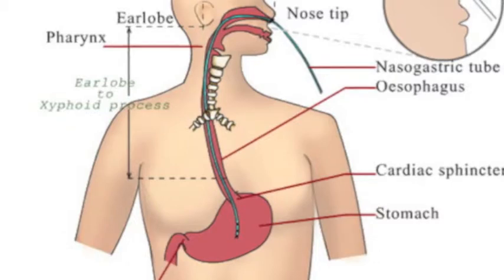Xiphoid. Anyway, xiphoid, which is about here. You put a tape on there so you know where you're going.